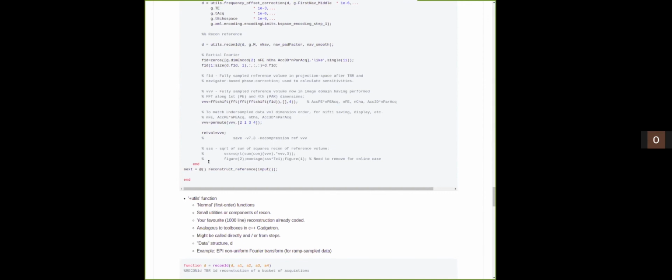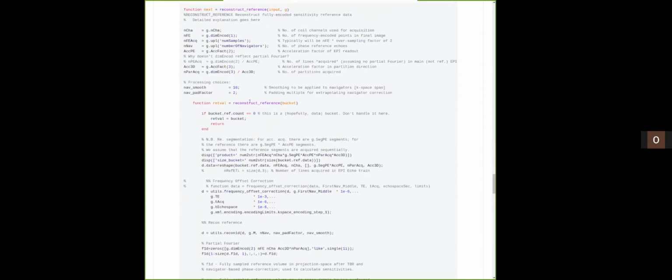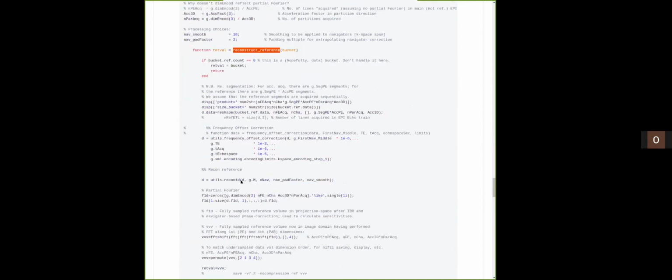So I want to just contrast that the internal function is returning data. To make sense with what I've just said, this should definitely be D here, but because it is referenced rather than accelerated data is why it doesn't look like this. But generically, this should be a D type thing that's being returned by the internal function, whereas when the chain is set up, it's only the pointer to the internal function which is being passed through to the chain.